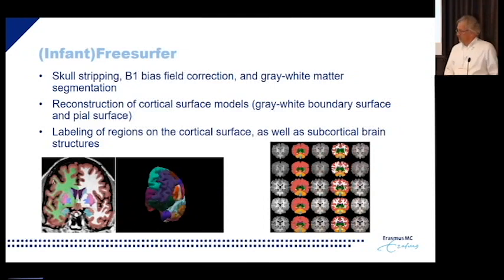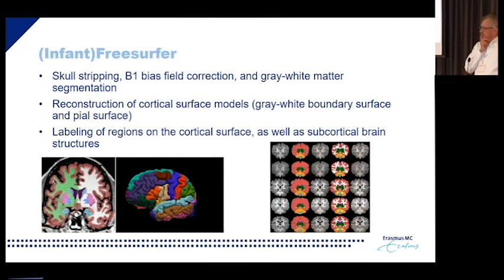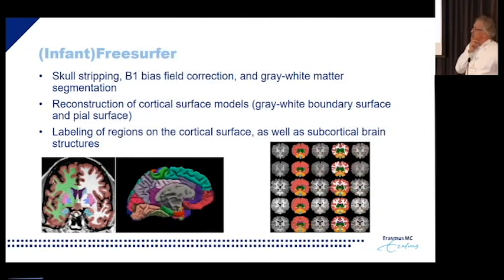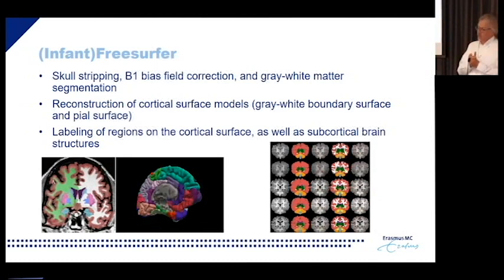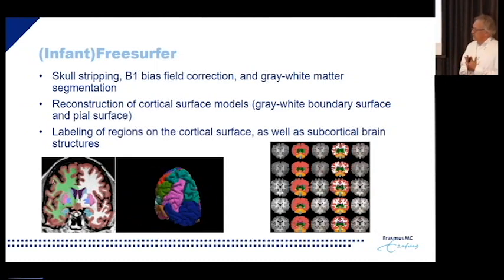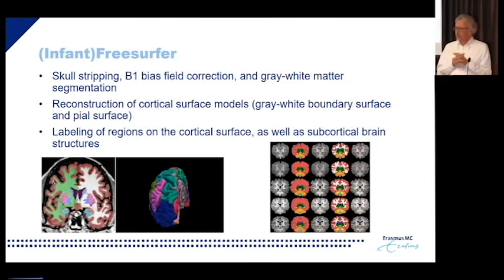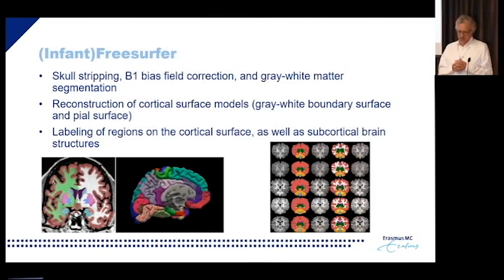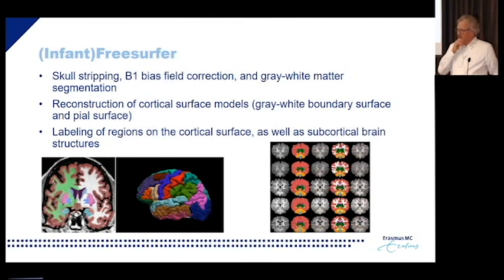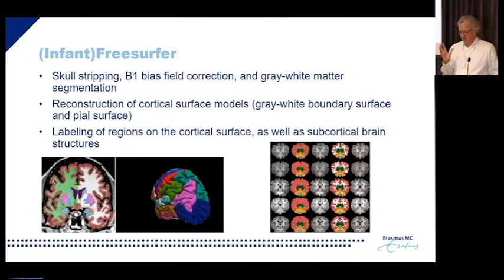Another tool is FreeSurfer. It's a tool that exists for a long time already. There is version 7 now. It is a tool just with conventional machine learning techniques, and it's doing a lot. For example, it starts with the skull stripping. So just get the skull out of the image data, doing all kind of corrections, and then again the tissue segmentation.